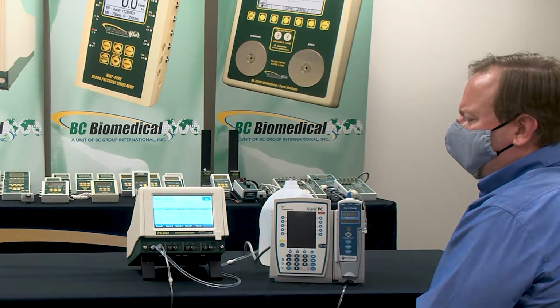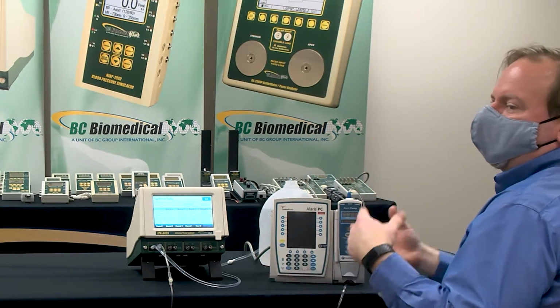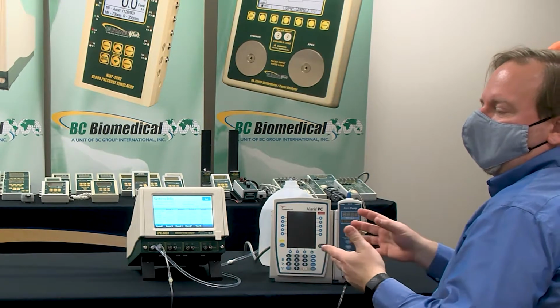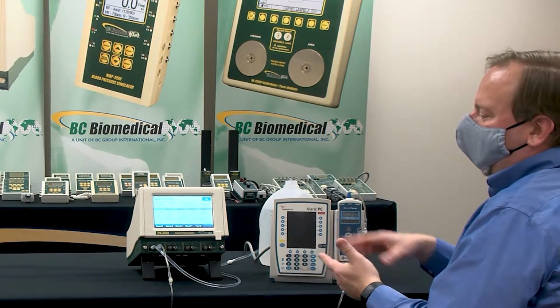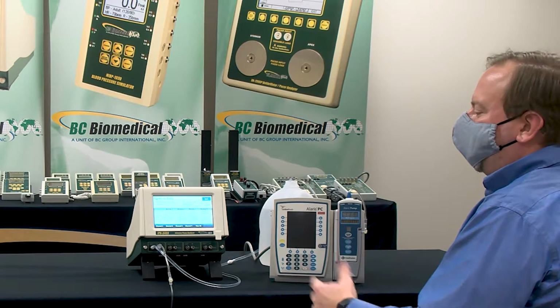And I don't think there's any alarm at this point. We didn't set up a "you're due for a cleaning" alert. It's really up to you to determine how much you're using it. I've got to clean it every time it gets to 500 or 100 or whatever. But then once you clean it, it resets that number. That would be nice to have a little warning though, if you set it for 300. When you hit the 300, it gives you a reminder. Yeah. Doesn't shut you down, but a reminder that cleaning is due.